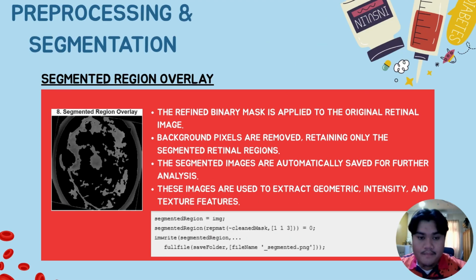Finally, in segmented region overlay, the refined binary mask is applied to the original retinal image. The background is removed, leaving only the segmented regions. And finally, the final image is saved and used for feature extraction and further analysis.